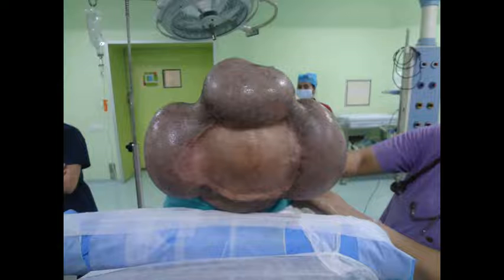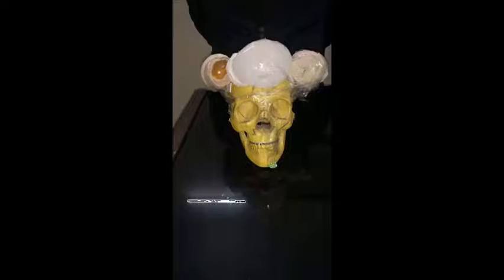We intermittently expanded these expanders which we had put and allowed to heal, and slowly every time we used to put in 100 ml, and once we were sure that we have reached the capacity of the expanders and it served our purpose, we simulated it on an artificial skull and calculated that this was enough.